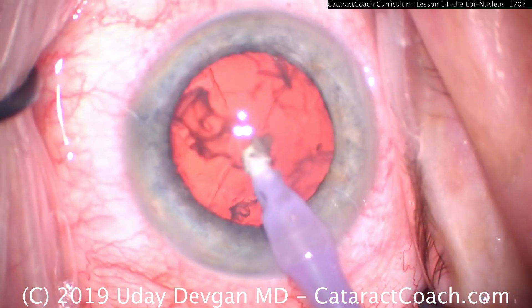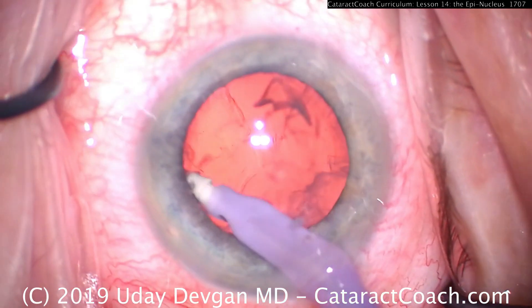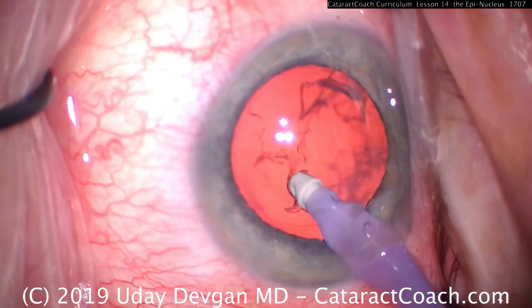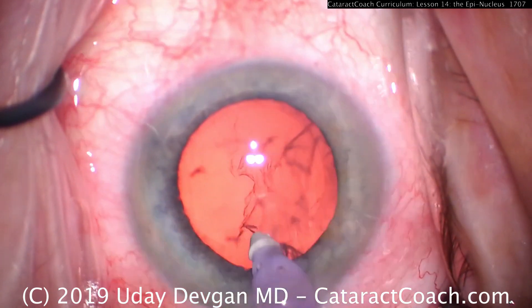Remember, it's bowl-shaped, and it conforms to the bowl-shaped capsular bag, so it can be difficult sometimes to even just get it outside the capsular bag — to lift it up. That's why, in this situation, we went underneath it, and that worked very well.